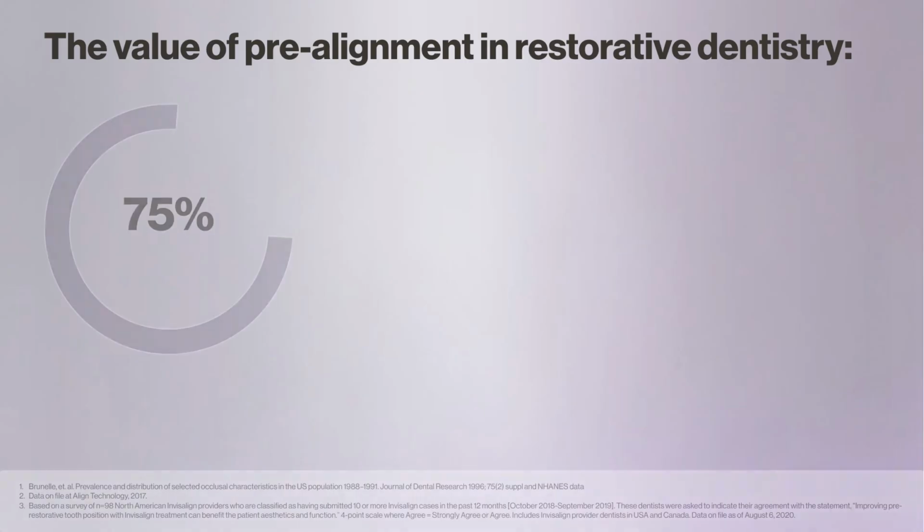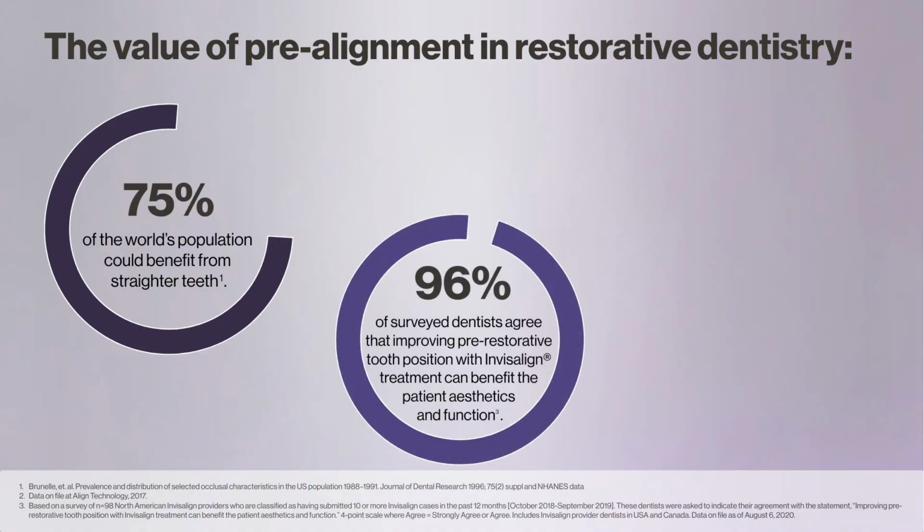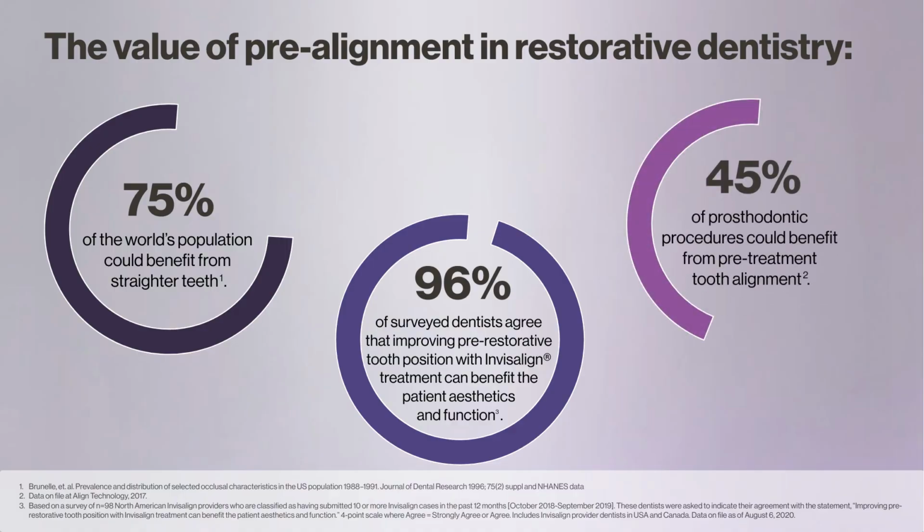Studies show that 75% of the world's population could benefit from straighter teeth. 96% of surveyed dentists agreed that improving pre-restorative tooth position with Invisalign treatment can benefit patient aesthetics and function. And 45% of prosthodontic procedures could benefit from tooth alignment before restorative treatment begins.